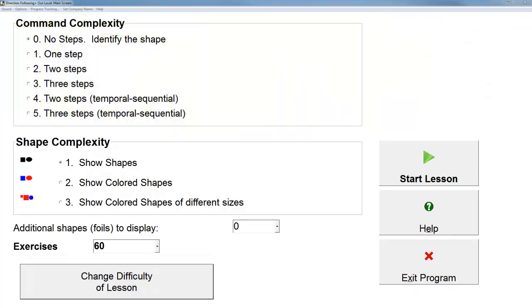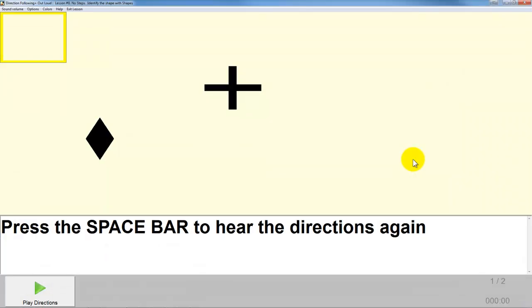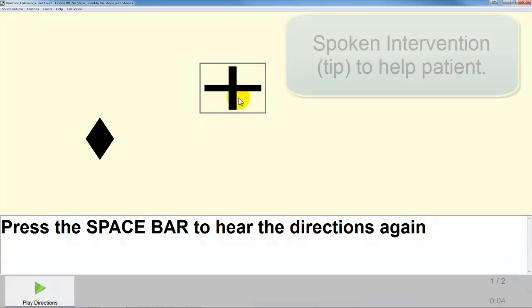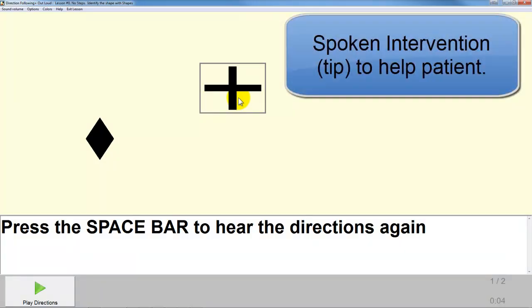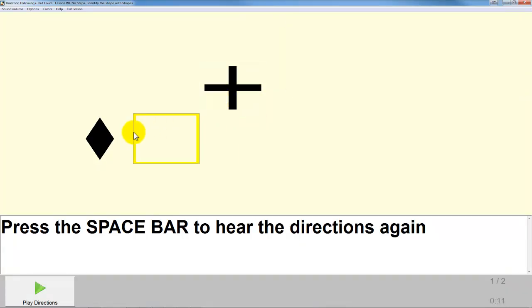Let's start by taking one of the easier lessons. Select the diamond. That is the wrong shape — that is a cross. You should be moving the diamond.